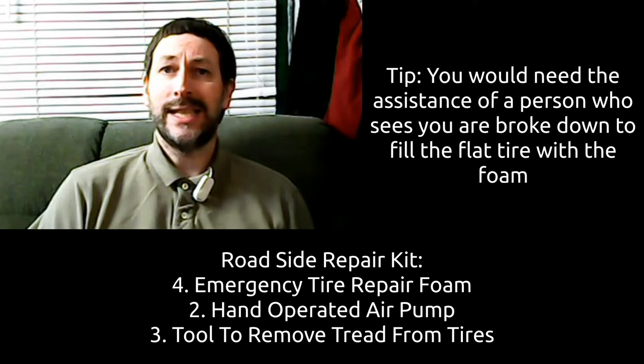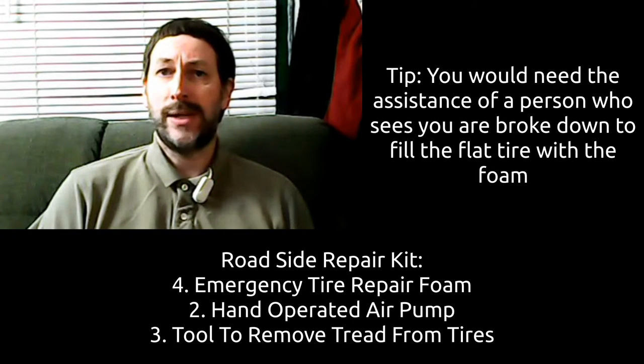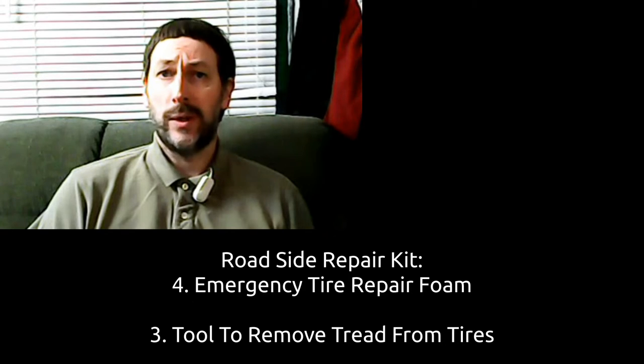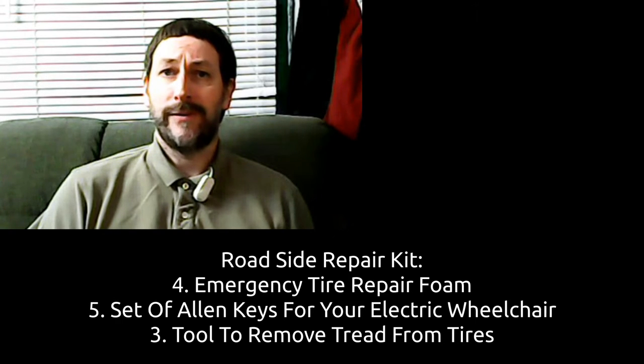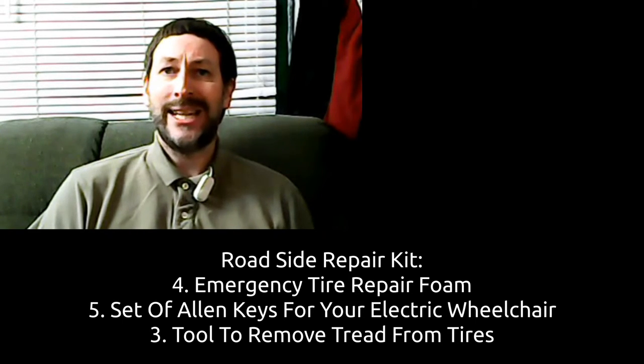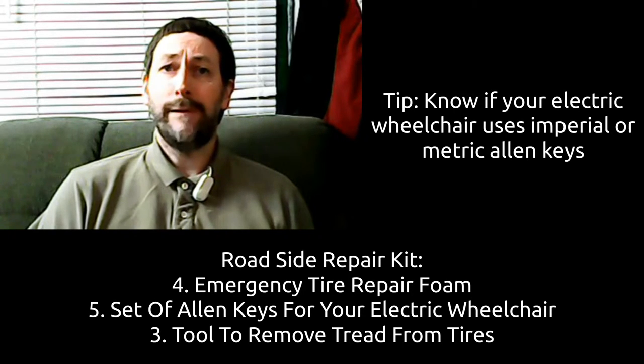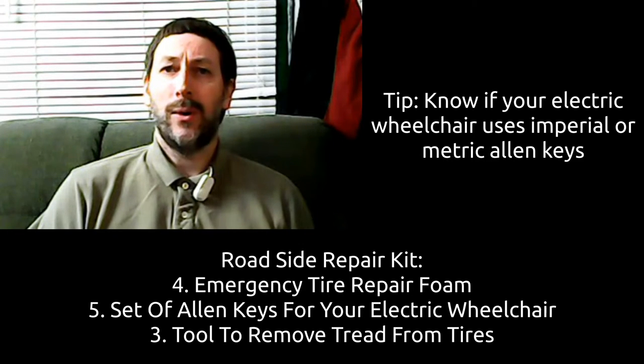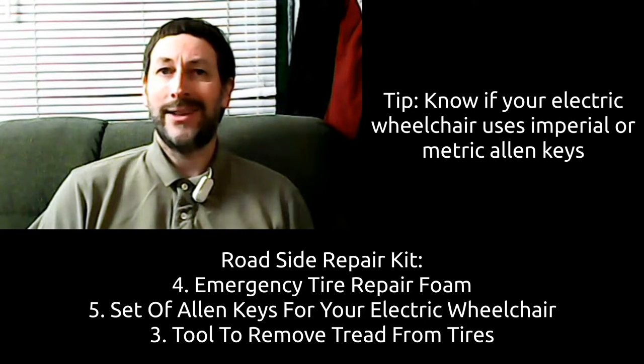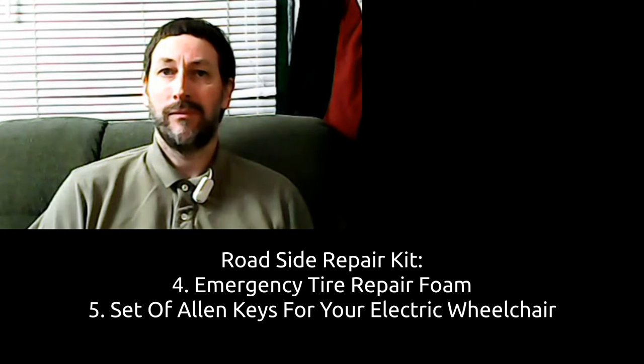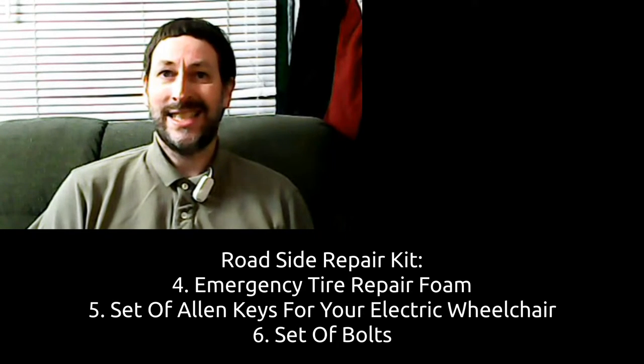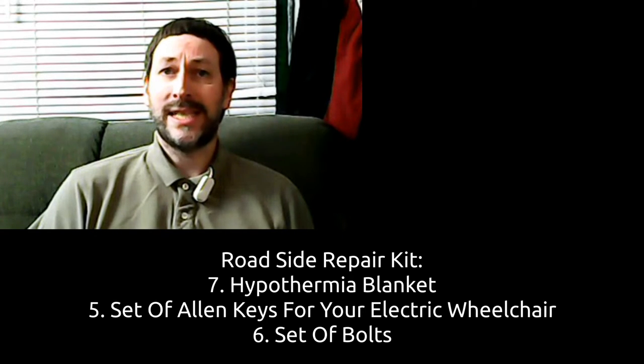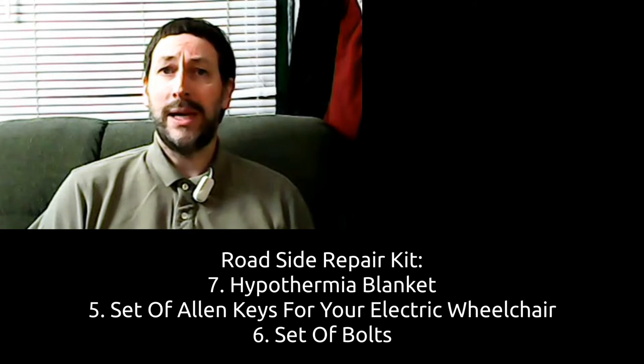A set of Allen keys for your wheelchair. Know if your electric wheelchair uses imperial or metric type of Allen key. Six, a set of spare bolts. Seven, a hypothermia blanket.